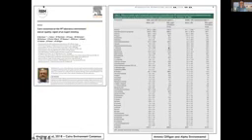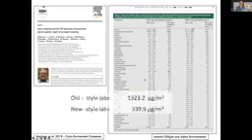So there are tables in this consensus paper, such as these, which list a lot of the VOCs. As I said before, there are tens of thousands, but these are the most common ones found in laboratories. These were the older style laboratories on the left, measured by one lab, the lab of Antonia Gilligan in New Jersey, a group called Alpha Environmental, and the modern laboratories that were purposely designed to reduce VOCs and aldehydes. There were significant diminishments of the total amount of compounds found. You can see that in the old style labs, it was about 4 times higher than in the new style labs. And often, not always, but often this was associated with improvements of outcome.